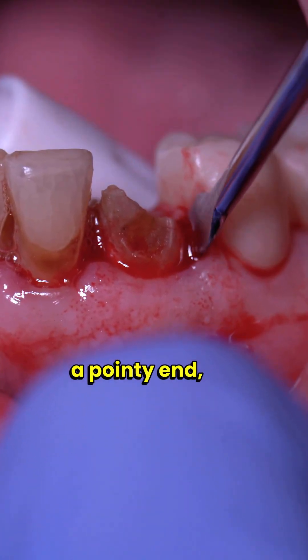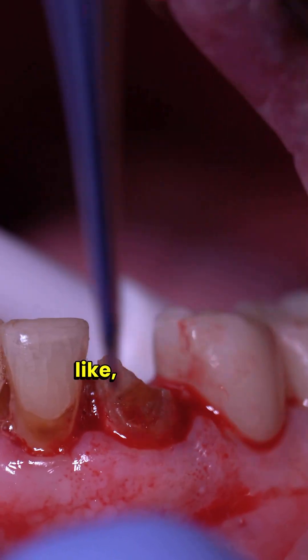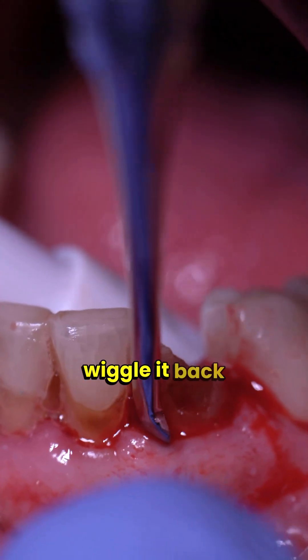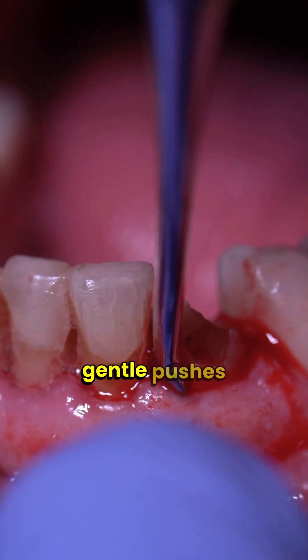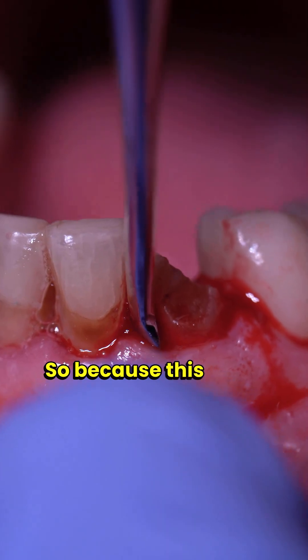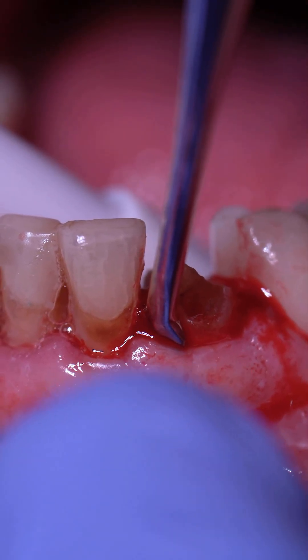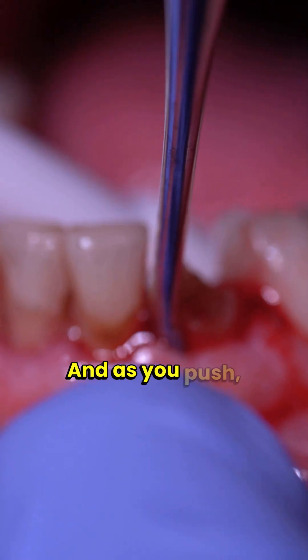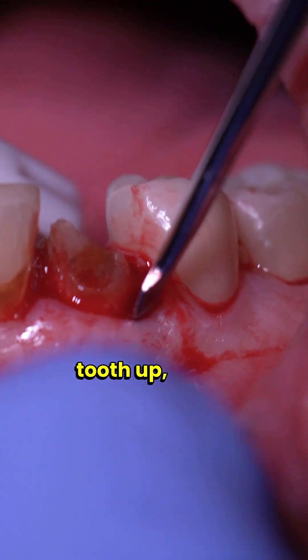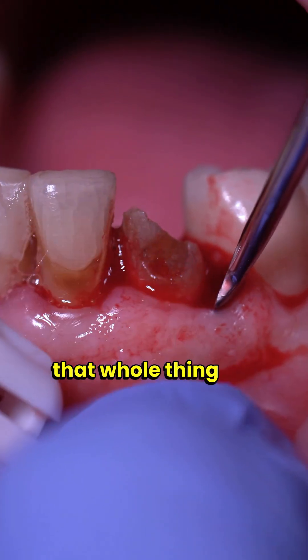Because it's got a pointy end, it's easy to get a purchase and lodge itself right in between the bone and the tooth, and then you're able to just wiggle it back and forth, give gentle pushes, and dig it deeper and deeper. This tooth is basically a cone shape, so it's going to be easy to just push, and as you push it's actually going to be bringing that tooth up — pushing into the wedge will dislodge the tooth in the socket and bring that whole thing up.